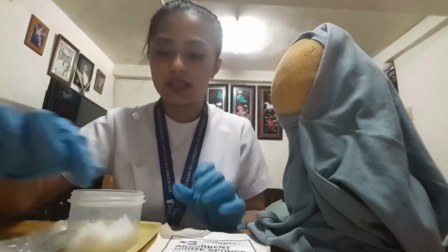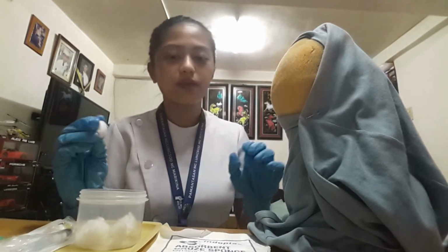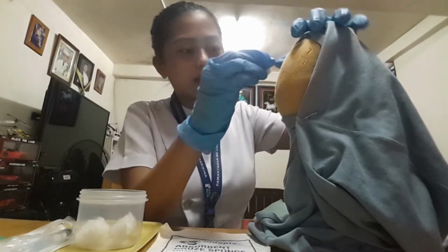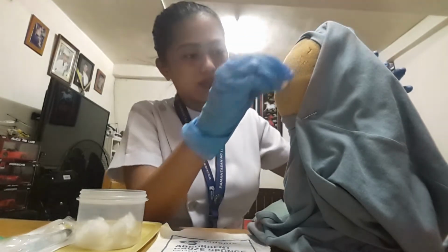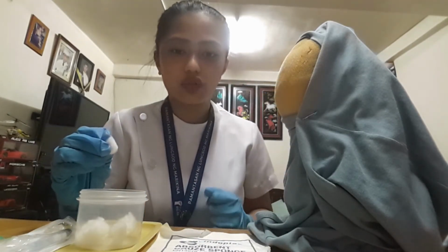Right. So I've switched the position of the improvised arm, because I am right-handed. And then after that, we need now to clean the site. In cleaning the site, we use cotton balls and clean the site with a circular and firm motion from inside going to outside. And then after that, allow the antiseptic to dry.